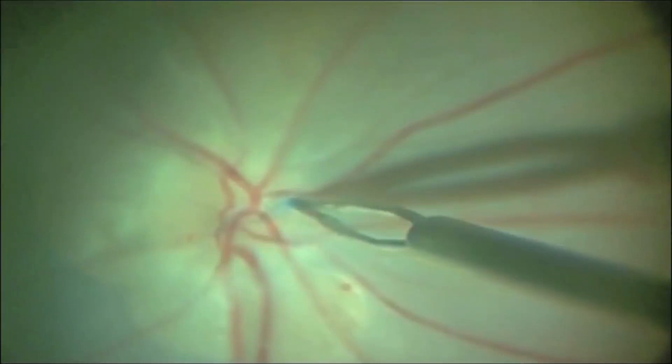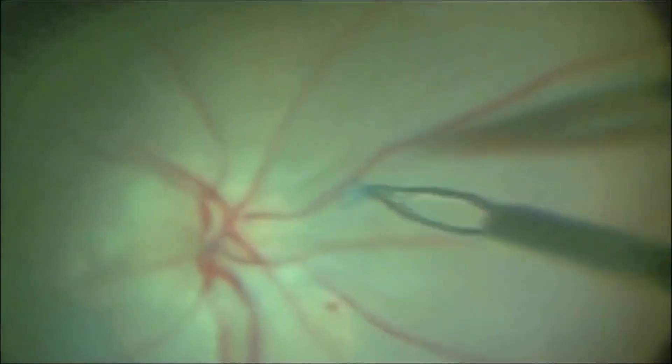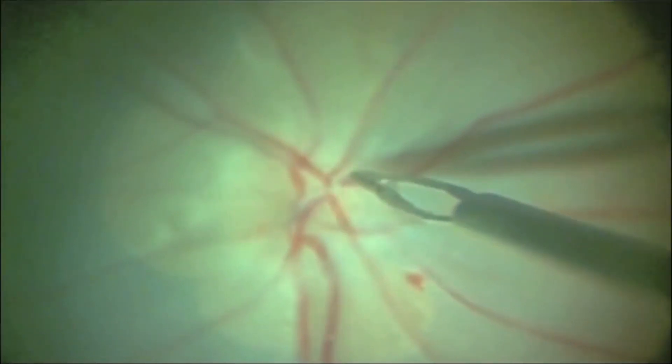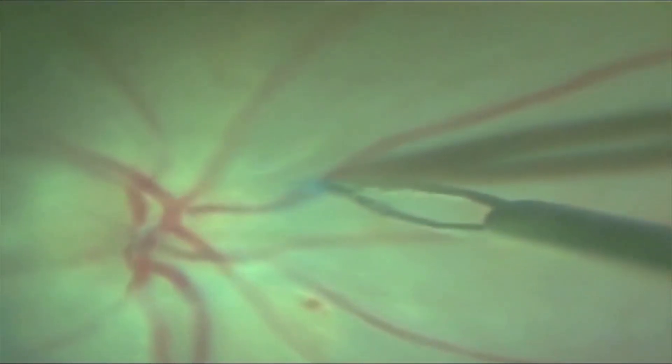Disc dissection is basically a de-roofing of the disc by dissecting the central disc meniscus. This decompresses the retinal vessels as they emerge from the lamina cribrosa. It also helps to further reduce the resistance to flow across the central retinal artery and helps the embolus to migrate towards the lamina cribrosa of the optic disc.